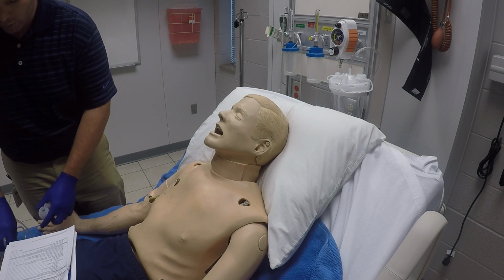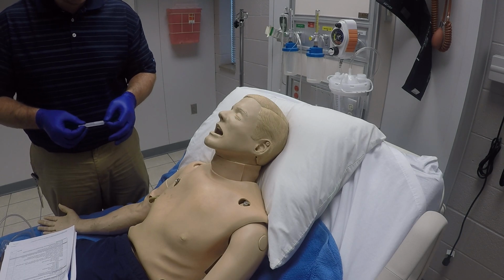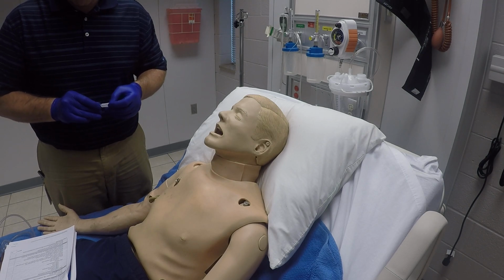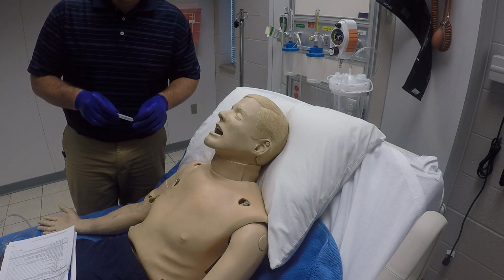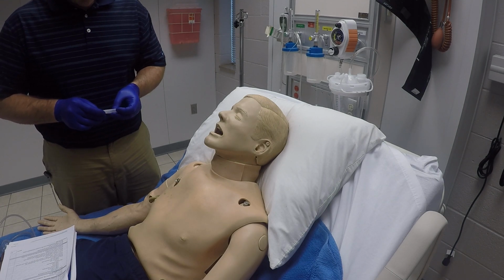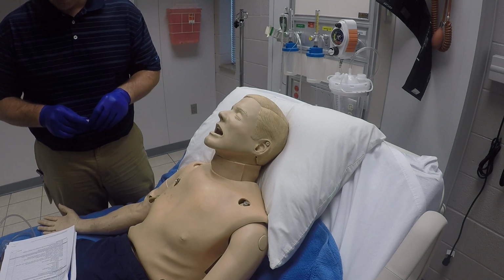First thing we're doing is take our medication, check our 5 rights, make sure it is the right patient for this medication, make sure it is the right medication that we want to be giving, the right dosage and concentration of the medication, it is the right time to be giving it, and it is via the right route, which is going to be inhaled through a nebulizer system today. We also want to check that medication and make sure that it is clear, there's no particulates in it, and that it is not expired.